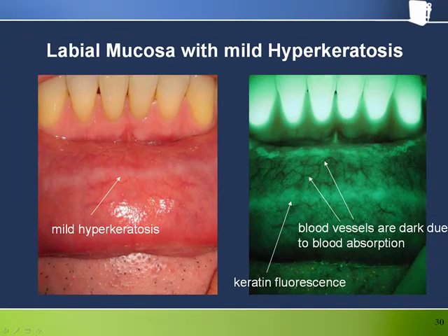An analogous phenomenon to linea alba on the buccal mucosa can occur on the labial mucosa due to irritation from the front teeth. In this case, we see classic mature non-inflamed hyperkeratosis, which appears brighter under the Velscope due to keratin fluorescence. Note also how well the dense collections of blood vessels can be visualized under fluorescence due to loss of fluorescence from blood absorption.